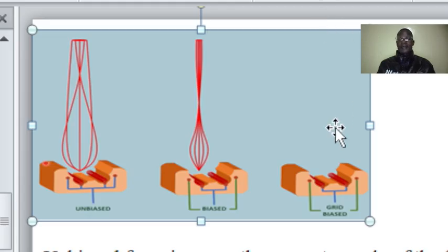They're being repelled down. So this leads us to the realization that depending on the amount of electrons that you want to produce, or the type of filament that you want to use, you'll be able to acquire different beams.